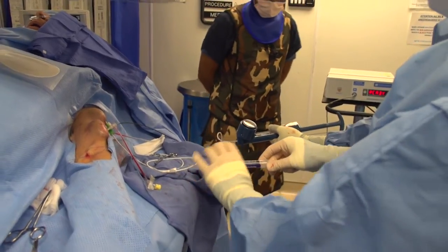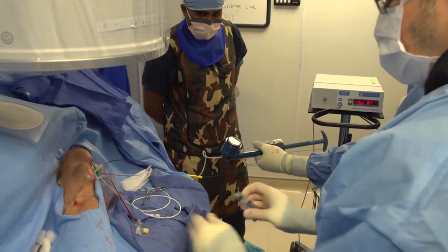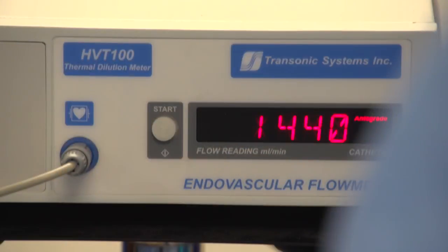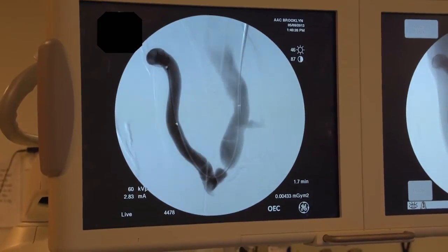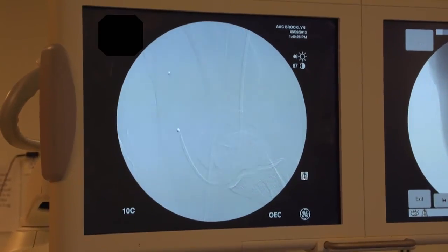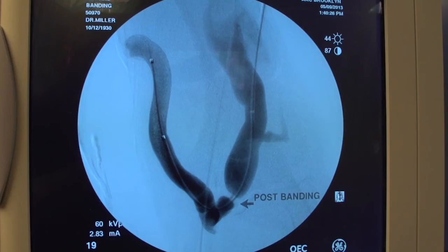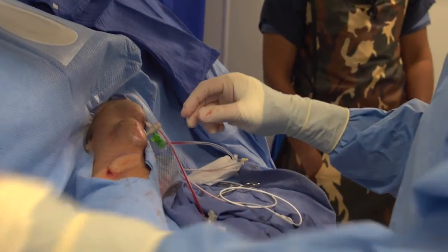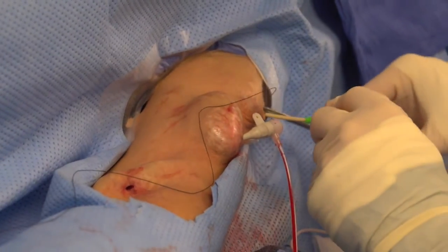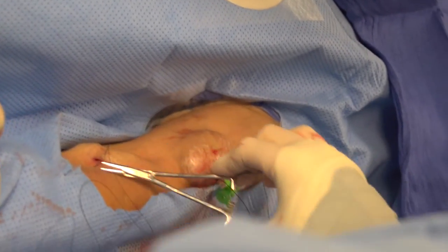We repeat the flow measurements, performing two measurements to get the correct number. You can see we've reduced the flow by approximately 45%. Once we're happy with the result and there is good flow in the access, we perform another arteriogram where you can see the band has created a precisely measured ligature of exactly four millimeters in diameter. We then remove our wires, suture the sheath sites, suture the banding site, and the procedure is done.